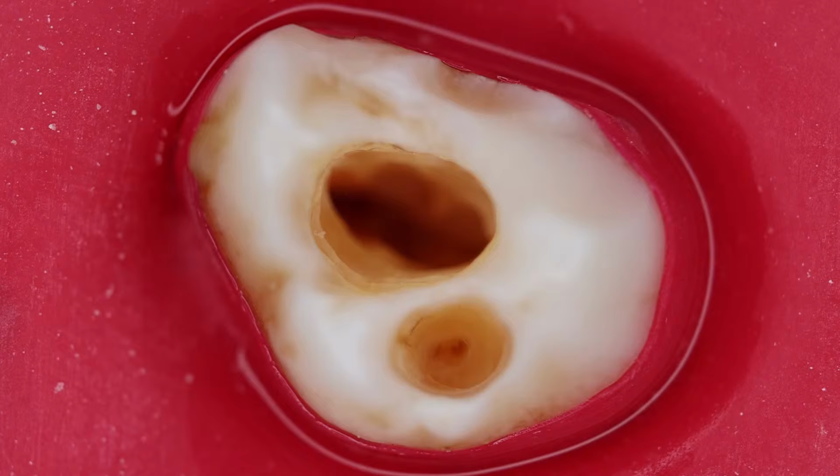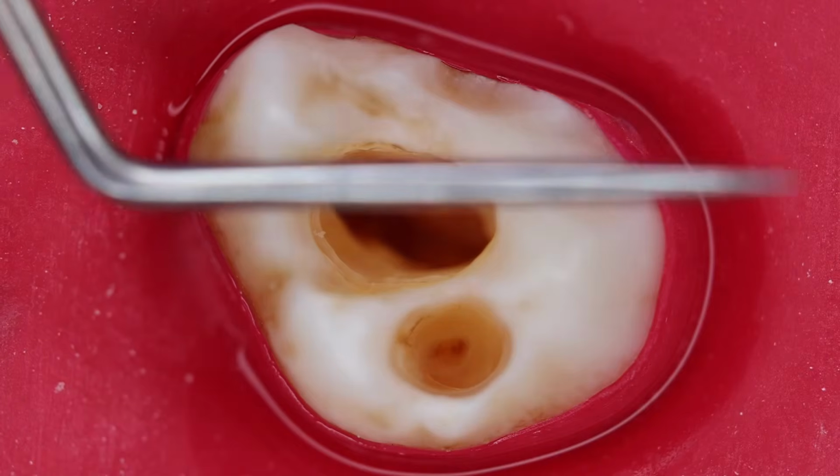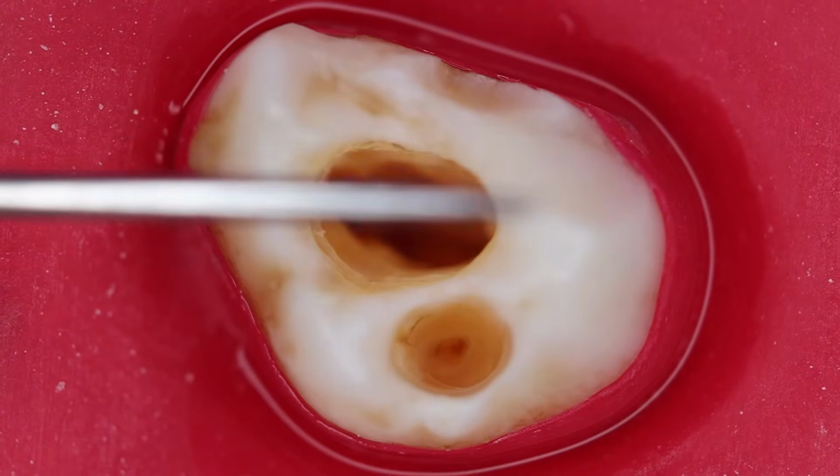This step involves determining the working length, that is, how much length we should be preparing the roots. Basically we should be cleaning and shaping these roots. So let us first negotiate the canals that we were able to find. We used the DG16 probe to negotiate the canals.